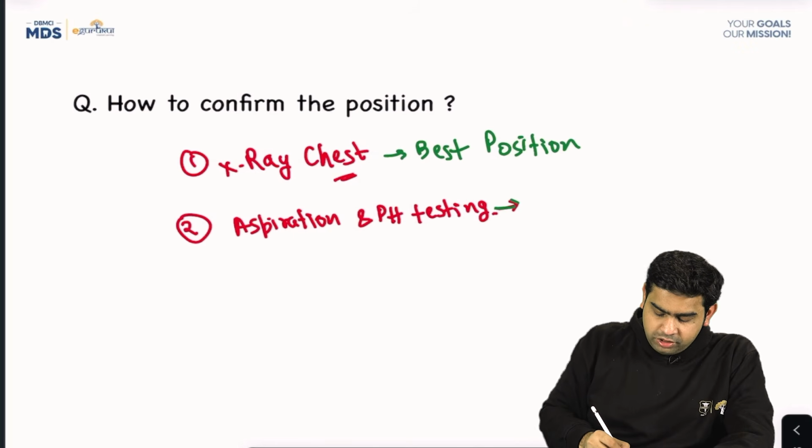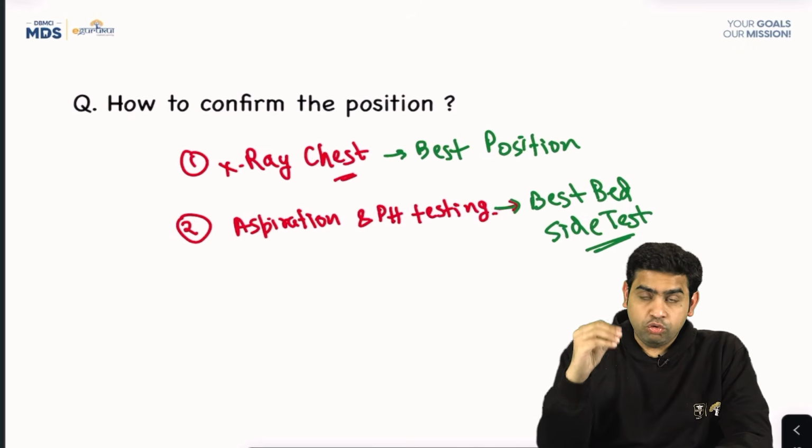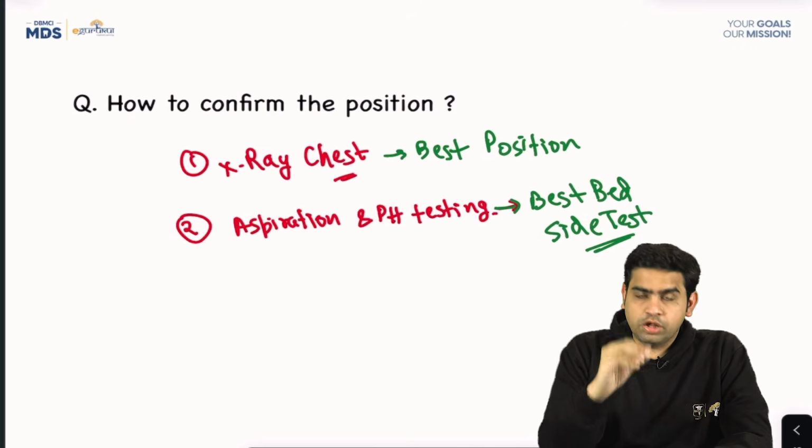So this is a very good bedside test, the best bedside test to know whether the nasogastric tube has reached the stomach or not.